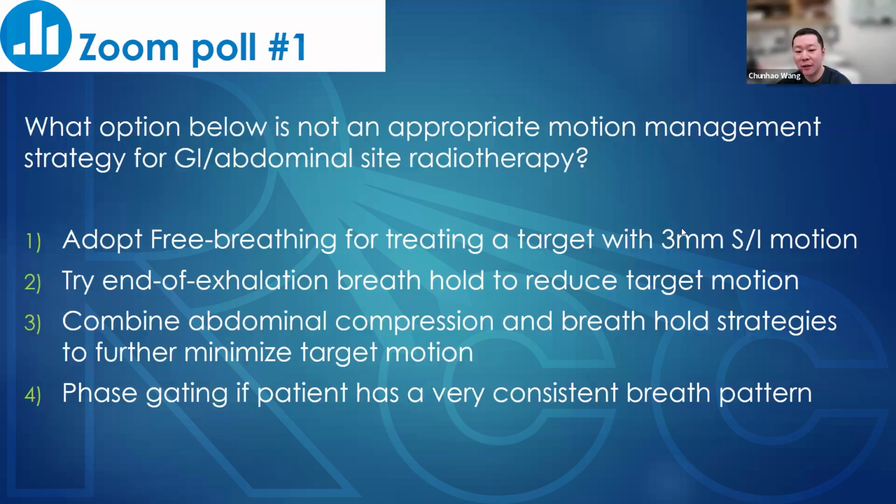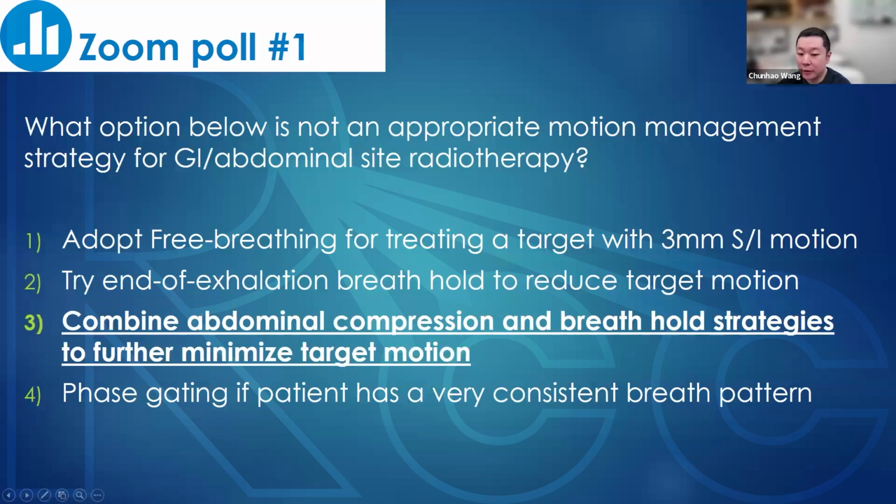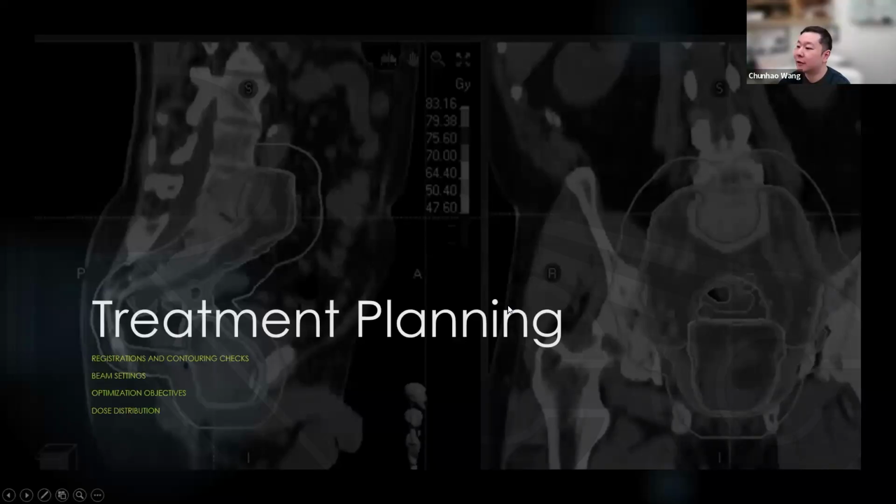So the answer here should be number 3. Again, we cannot combine abdominal compression and breath hold because they're just too painful for most patients. Thanks everybody for the participation in the poll. So now let's move on to the treatment planning.